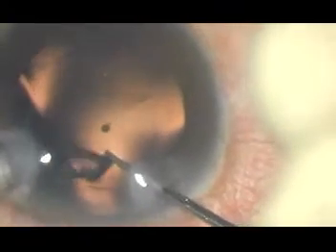How is the surgery with this lens? We use micro-incisional cataract surgery through incisions of less than 1.2 mm, and then we enlarge the incision to 1.7 to 1.8 mm. The lens is then implanted.